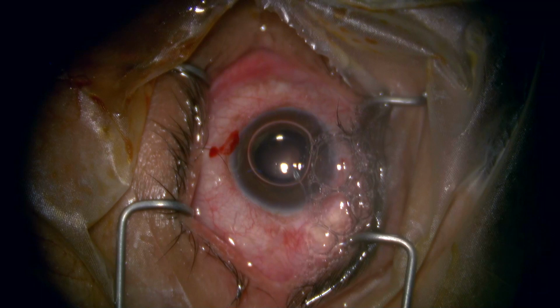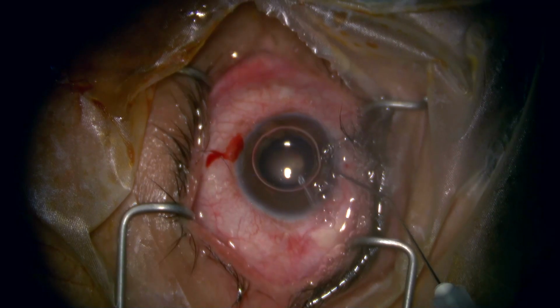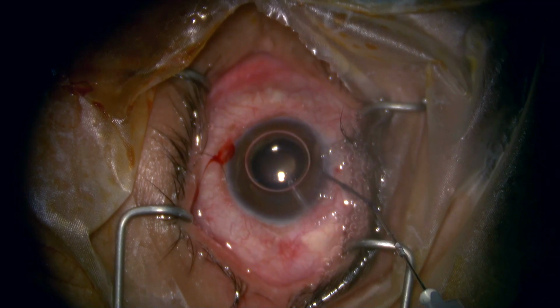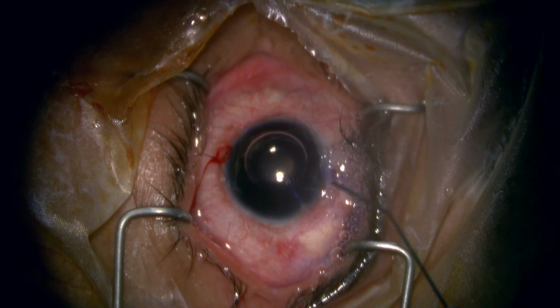So now we have done the side port superior, and the supero-nasal side port is being made to avoid touching the bleb, and the inferior side port is being made. Now we are performing routine staining of the anterior capsule under the air bubble.